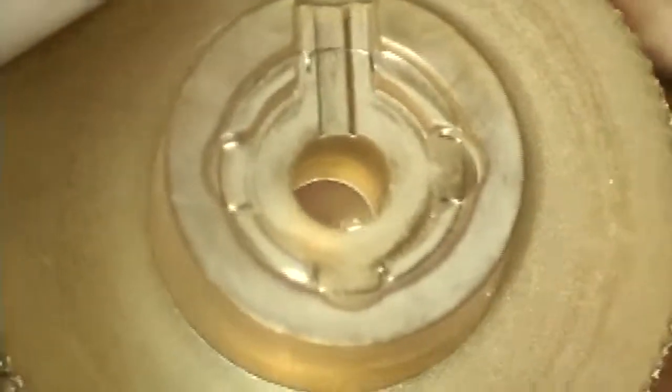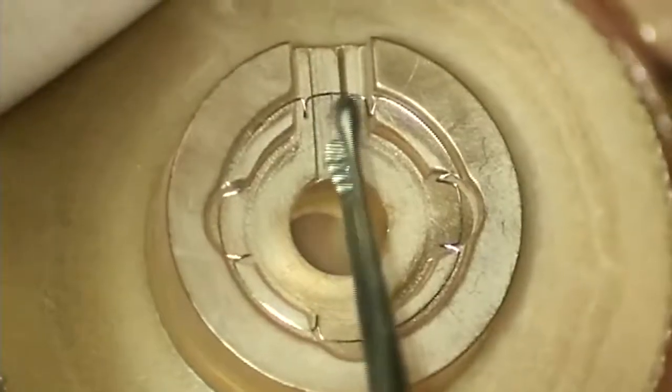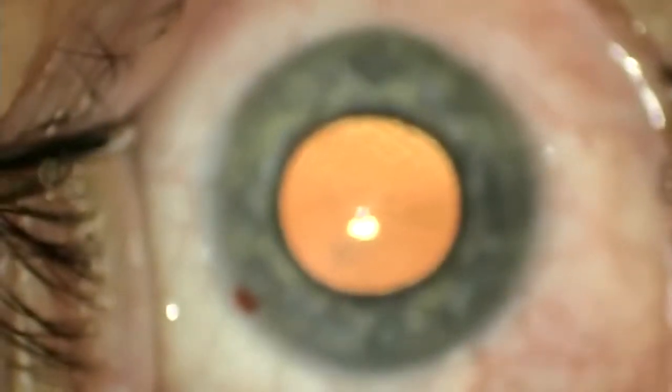Insertion forceps are included with the ring, and there's also an injector very similar to the Malyugin ring injector. My preference is to insert and remove the ring using the provided forceps. I grab the ring — being very careful not to compress it — and try to grab it as distal on the forceps as possible.